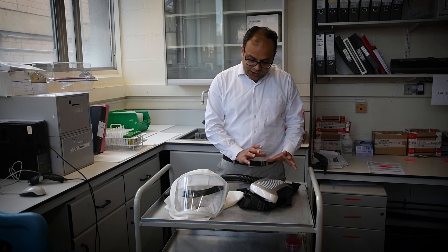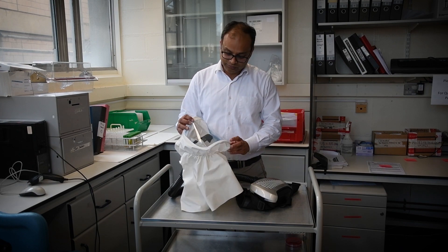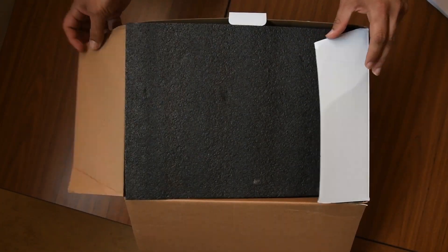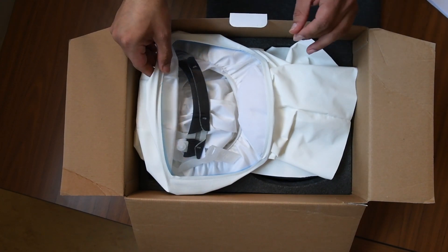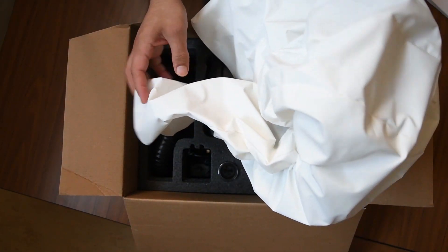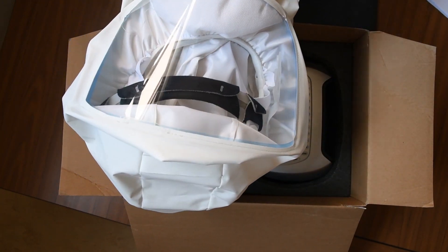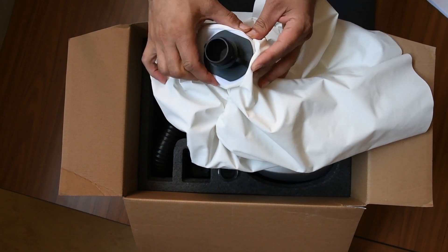In summary, when you are using this properly, this device could be life-saving. When you open the box, the first thing you will see is the hood. You can have a close look at the hood, and this is the attachment for the tube.